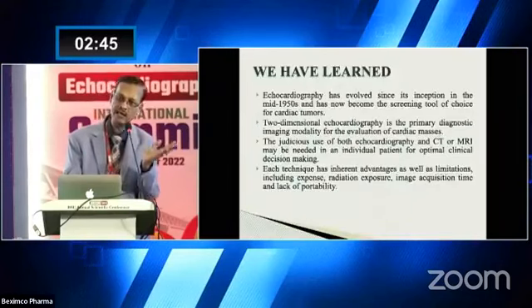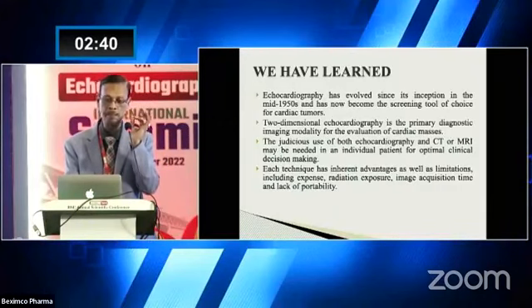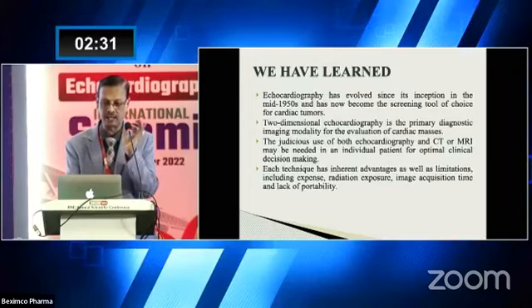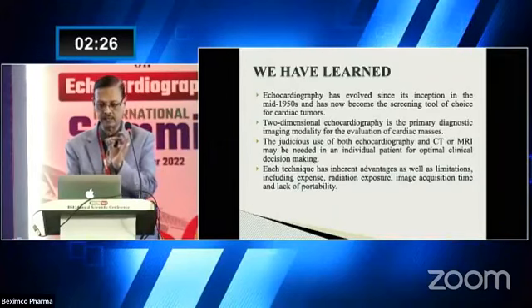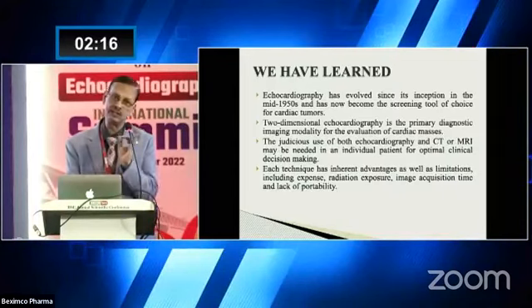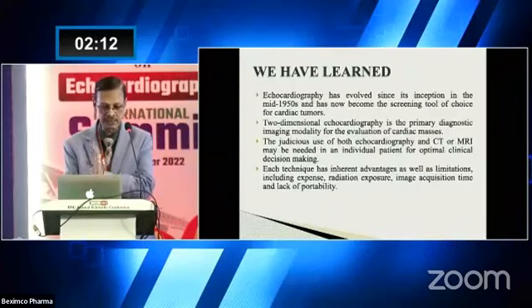So what we have learned from this: echocardiography has evolved since its inception in the mid-1950s, and has now become the screening tool of choice for cardiac tumors. Two-dimensional echocardiography is the primary diagnostic imaging modality for the evaluation of cardiac masses. The judicious use of echocardiography, CT, and MRI may be needed in an individual patient for optimal clinical decision-making.